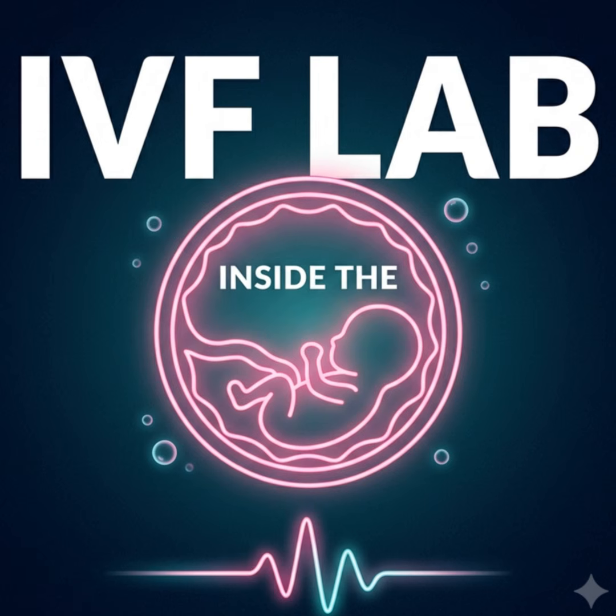We have high-definition cameras capturing thousands of data points. We have artificial intelligence scanning millions of pixels to calculate morphokinetic trajectories and flag direct cleavage. It is an absolute technological marvel. But does all of this actually lead to more successful pregnancies? That is the million-dollar question.